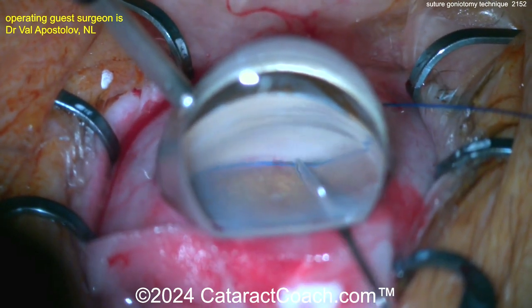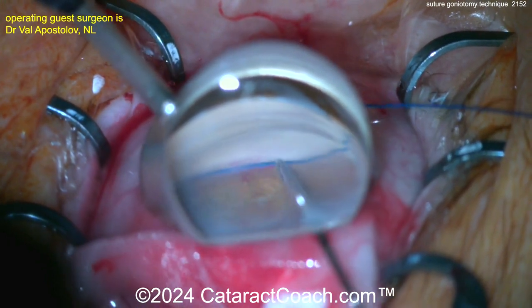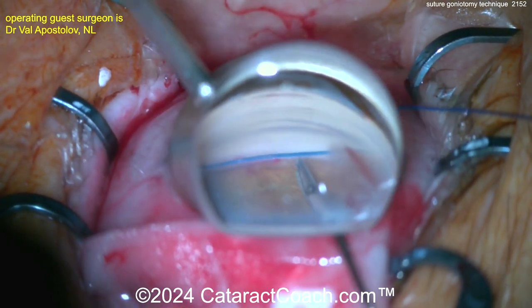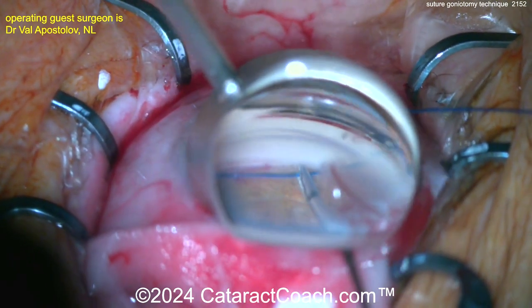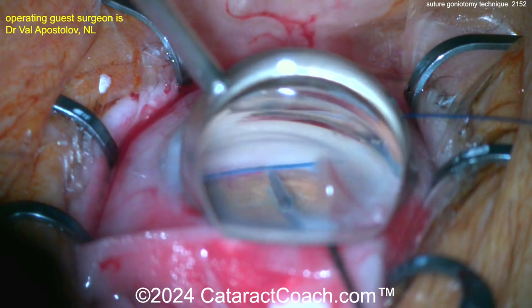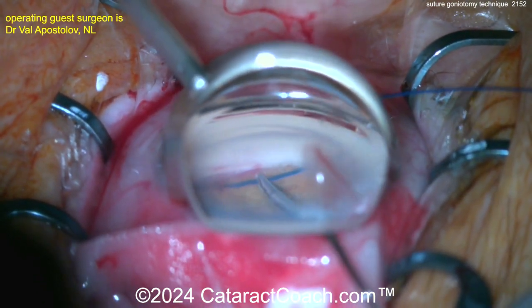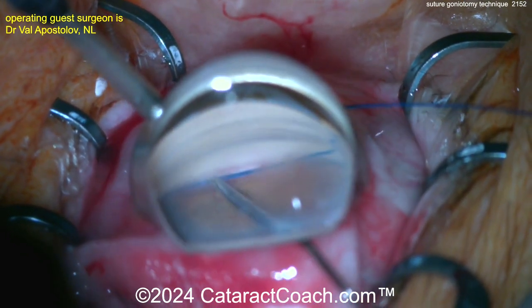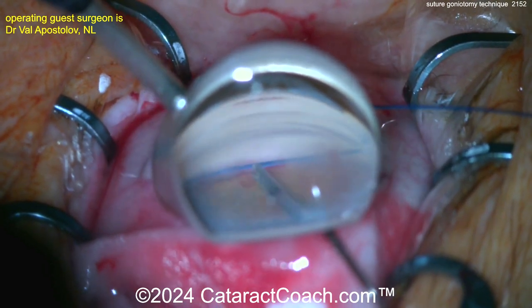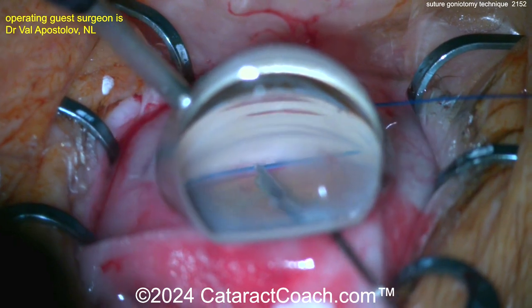This is a very interesting case and a technique we haven't really featured much on CataractCoach. Slowly advancing it now — if you run into resistance, be careful not to create a false passage. At that point you may decide you've done enough and proceed from there.